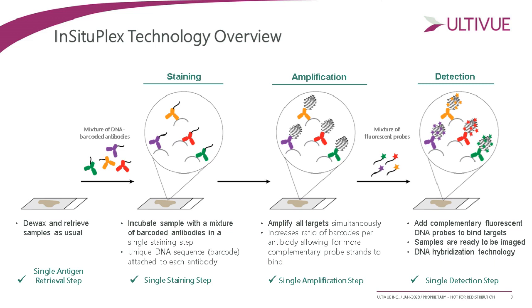So the next step after the primary incubation, the staining step, is the amplification step. This is basically a linear amplification that happens at the same time and same rate for all the antibodies that we use in the primary incubation step. This allows also the identification and quantification of a broad dynamic range of expression, and it happens by elongating the DNA sequence of each of the antibodies.